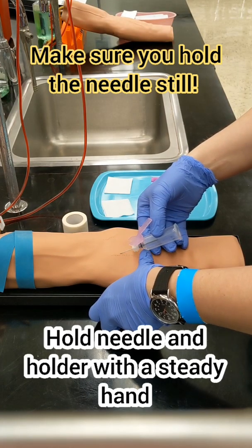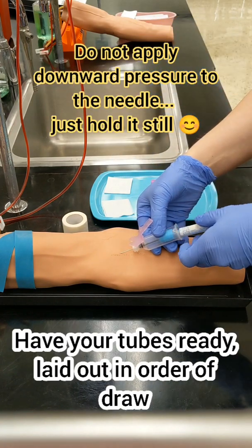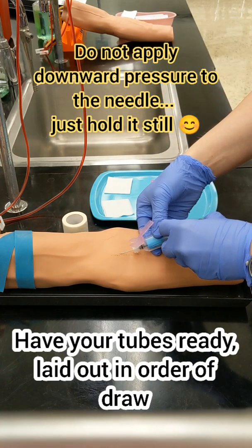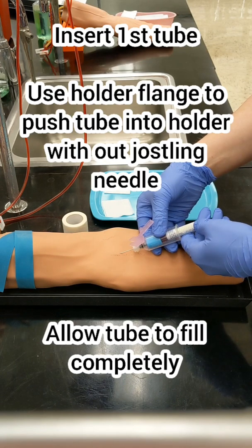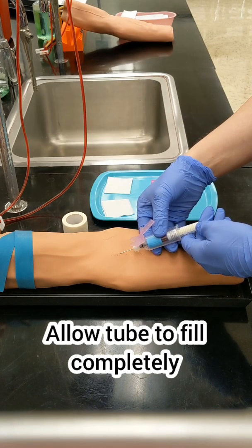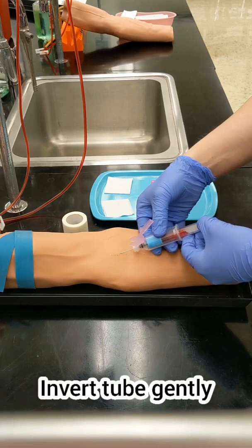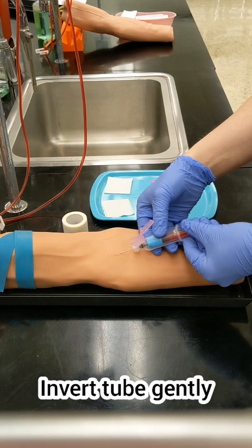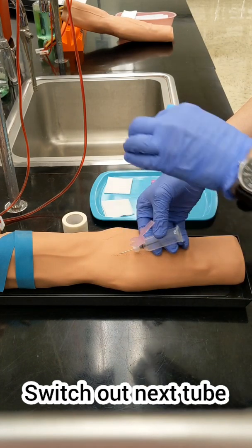Hold the needle and the holder steady once you're in there and grab your first tube. When you insert the tube, make sure you're using the flange on the holder to insert the tube without jostling the needle around, which can hurt your patient. You will know that the tube is done filling when blood stops flowing into the tube. Remove that tube, invert it gently, and then switch out to your next tube in the order of draw.